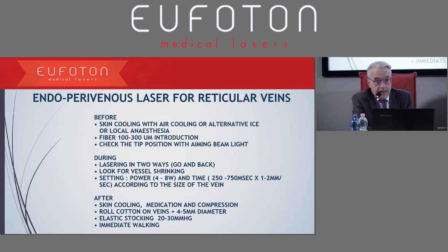But what should we do before the treatment? Well, the skin cooling, as I said, with air cooling or alternatively ice. And this is fundamental to avoid collateral or side effects.